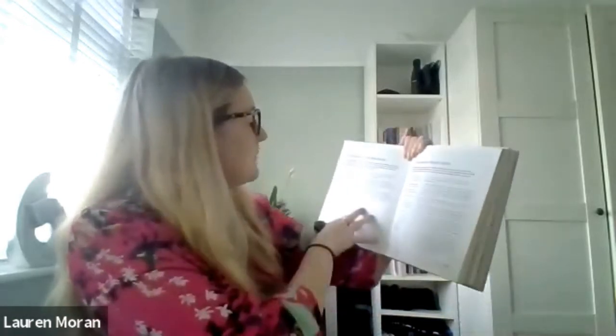So for example, on this one, I'm going to use my chocolate chip brownie. So I want to hear the recipe for my chocolate chip brownie. I'm going to position the text, point my device towards it, and press the trigger button. And then when I'm happy with the position, I'm going to release it and it's going to read it back to me. Let's try that.